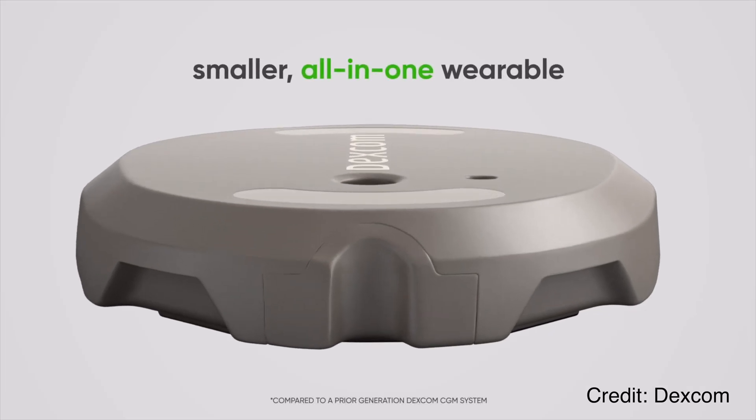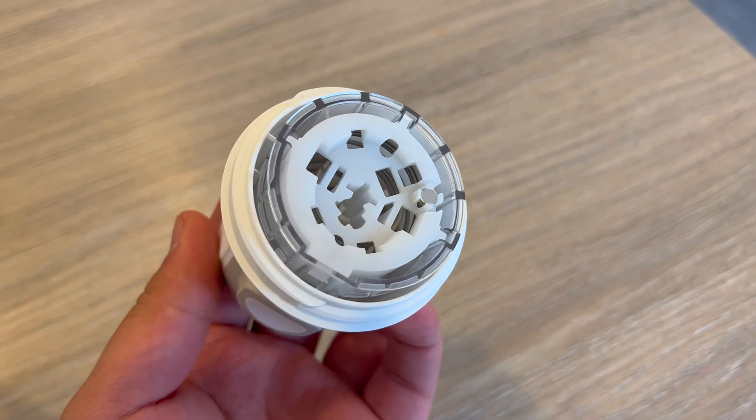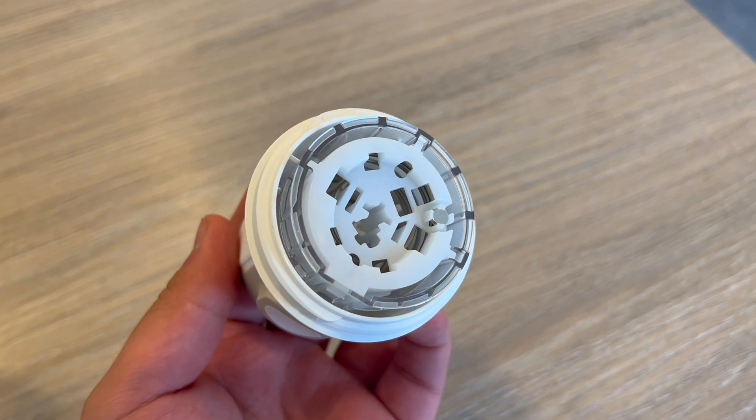What it basically means is that as soon as you physically apply the sensor on your body, the countdown starts ticking. The tech behind it is actually pretty clever. Each G7 applicator is equipped with a tiny magnet — you can actually see it in the applicator body. Each G7 sensor has a similar magnet built in. When you release the lock and apply the G7 sensor, the G7 magnet stays on your body and the applicator magnet is separated. As soon as the magnets are separated, the 30-minute clock starts ticking.